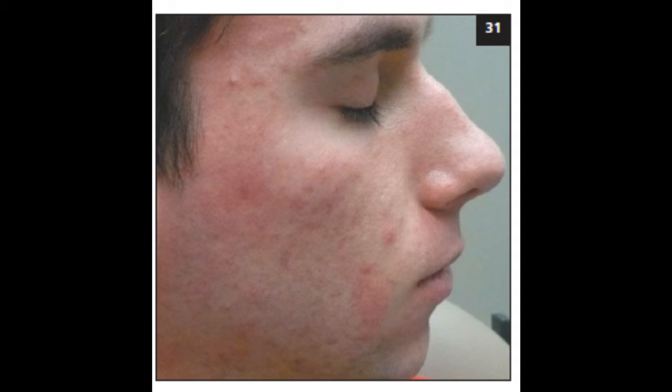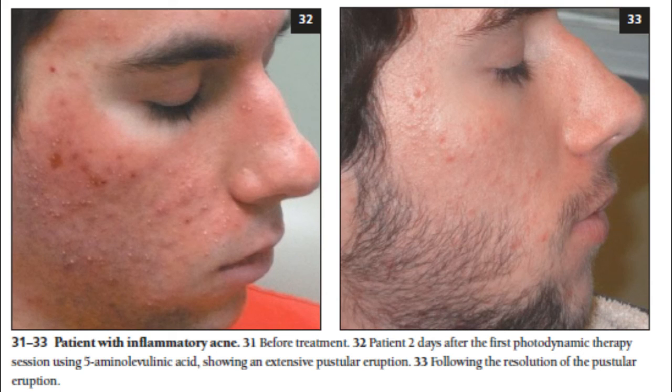According to Ohm's law, this flow, or electrical current, increases with decreased tissue impedance. As per Joule's law, such current also produces heat in direct proportion to the impedance, and volumetric tissue heating, expressed in J/cm3, is subsequently achieved. It has been proposed that such tissue heating may damage sebaceous glands, which may be further aided by the addition of intense pulsed light in some systems.